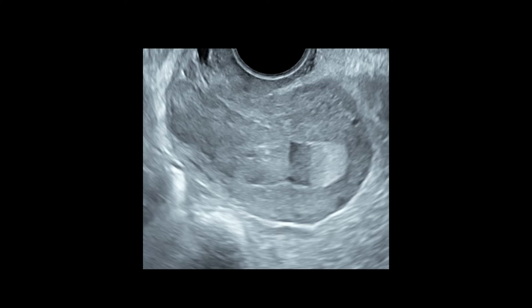This is transvaginal ultrasonography done before the histological diagnosis. The transducer is placed in the posterior fornix, so this is the posterior part of the uterus, and this is the anterior part of the uterus. We see this oblong mass within the uterine cavity. And we see retention of fluid in the rest of the uterine cavity.